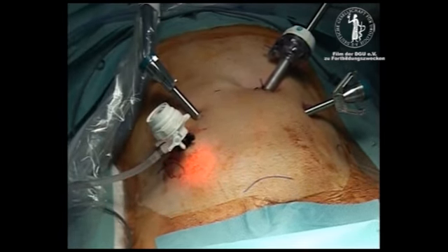Finally, the reusable 5 mm assistant trocar is placed between the right robotic trocar and the camera trocar as high as possible without puncturing the peritoneum.